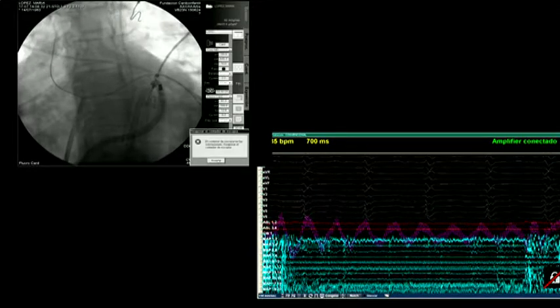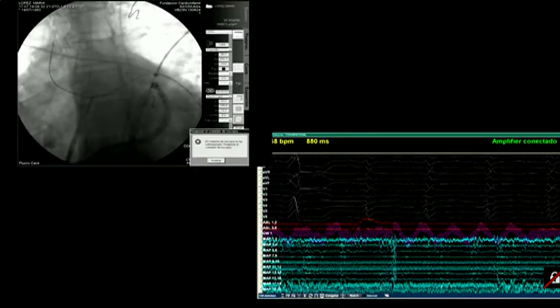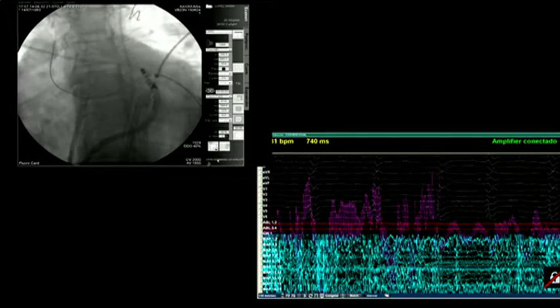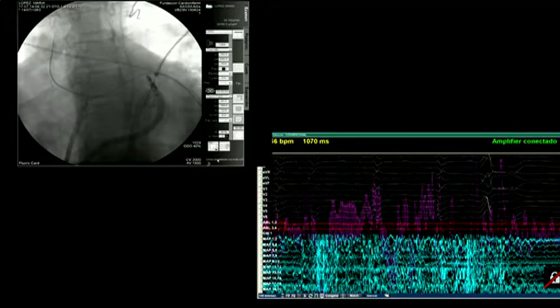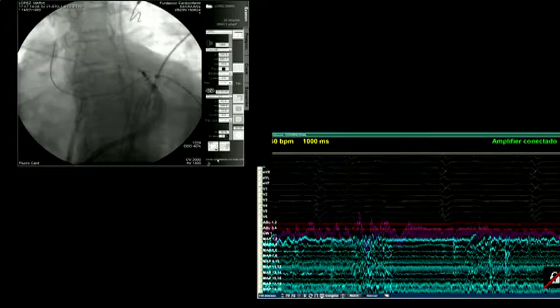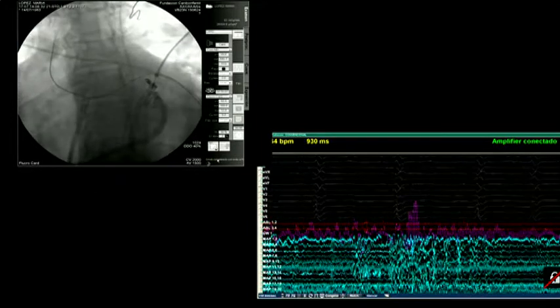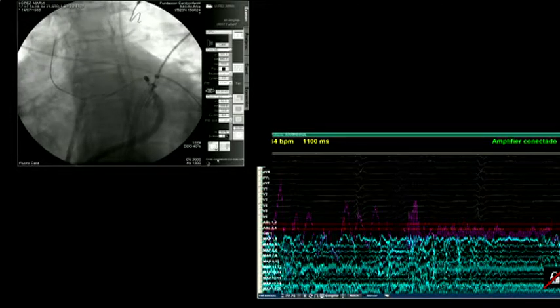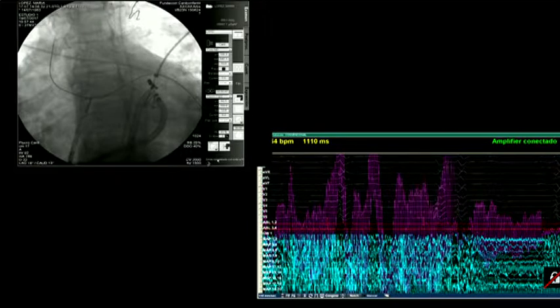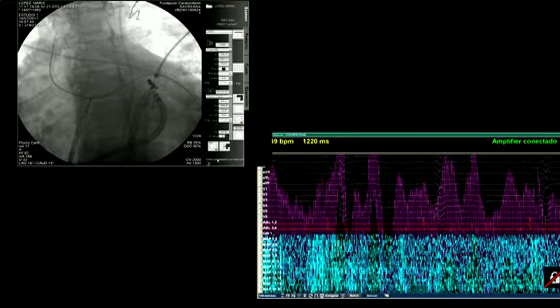Okay, so we are going to be applying on the coronary sinus. I'm a bit afraid because it's quite a rigid catheter and it is a small coronary sinus. But it was a democratic decision, wasn't it? Yeah. In the best style of Fermin's. Okay.